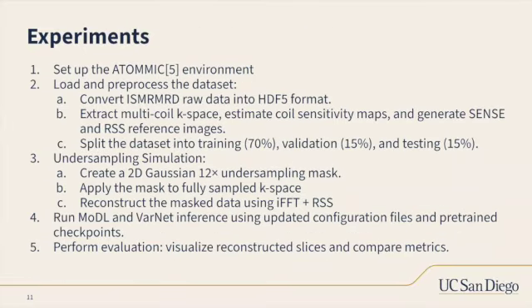We first set up the environment and load the dataset. Then we convert the raw data files into HDF files and extract the multi-coil k-space, the coil sensitivity maps, and the SENSE and RSS reference images. After that, we split the dataset into training, validation, and testing sets.